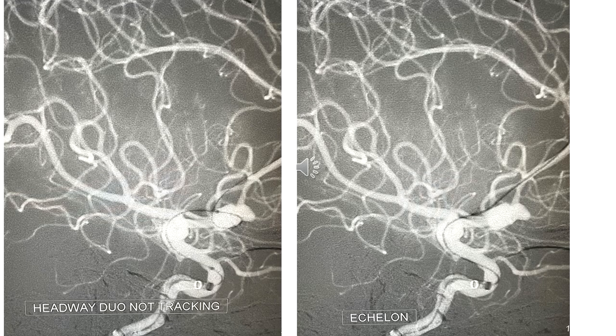The initial plan was to take a microcatheter in the A2, which is more involved with the neck of the aneurysm, and initially we took a Headway which did not track into this artery in spite of using a distal access catheter and manipulations. I was afraid to rupture the aneurysm as well because the microcatheter and the wire kept looping inside the aneurysm, so this was a difficult one.